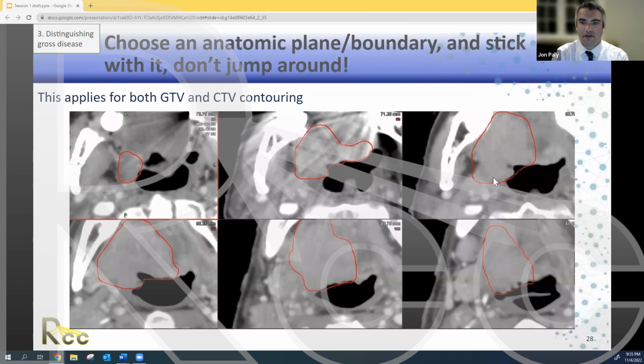you can see the outline here of the area of gross tumor, but in this slice, there's some artifact. And I've taken a little bit too much liberty contouring the soft palate or tongue base here, and it doesn't really fit with what I've contoured in these other slices over here. So obviously this slice is wrong, and we've failed to maintain a uniform expansion across our uniform boundaries as we've continued to contour. And if you were to look at this slice in a coronal view, you would see one slice sticking out in a jagged format, which would let you know something was amiss there.